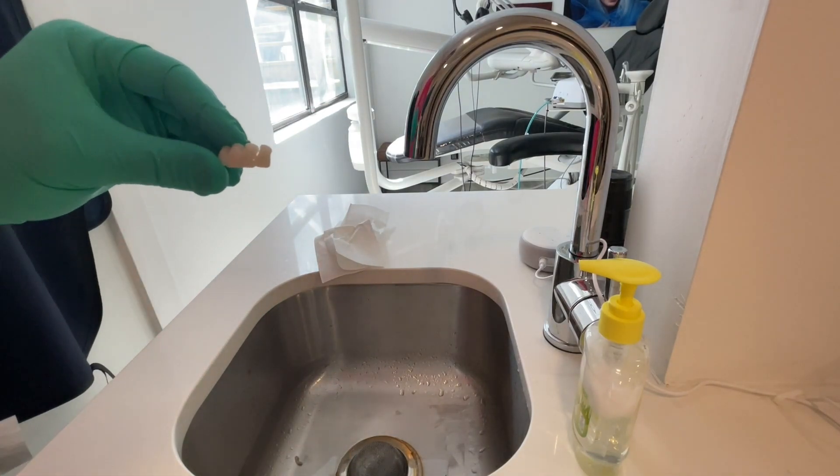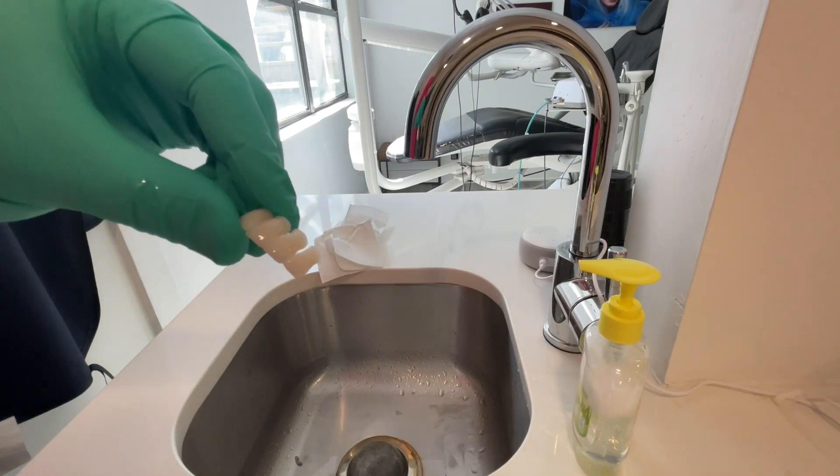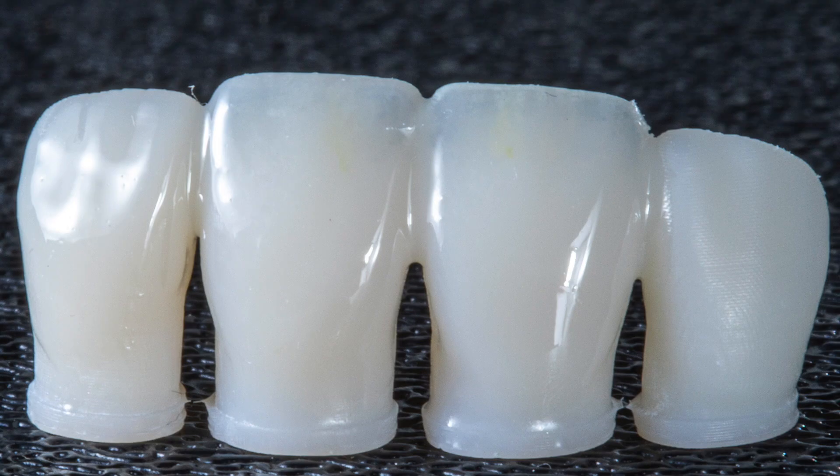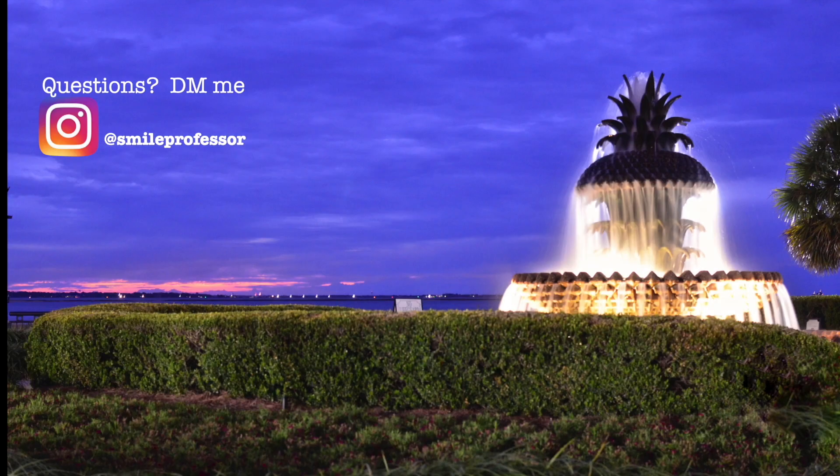It's a little hard to tell on my video camera, but we did get a really nice shine to those restorations — you can see it a little bit better here. You can appreciate just how diffused those stains look; it ends up looking really natural. You can also appreciate what that cotton did to the disto-incisal — I would obviously smooth that off if this were a real case. If you have any questions, feel free to DM me at smileprofessor on Instagram. Thanks for tuning in.